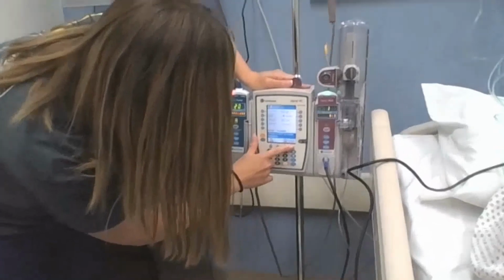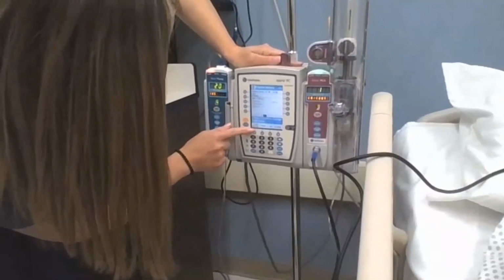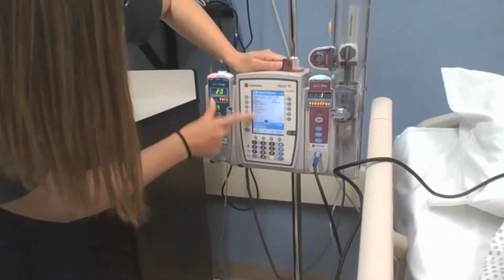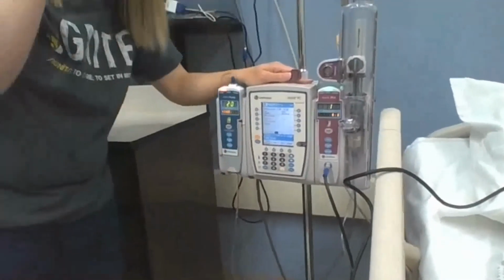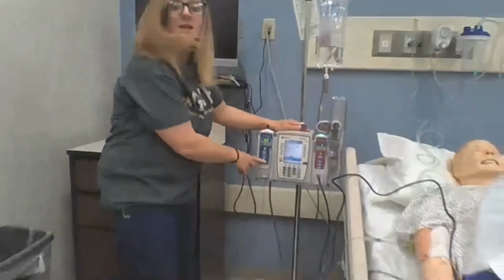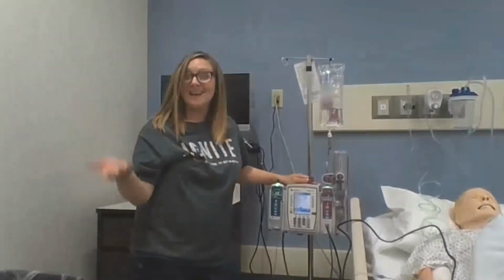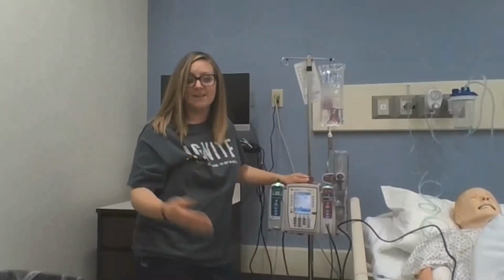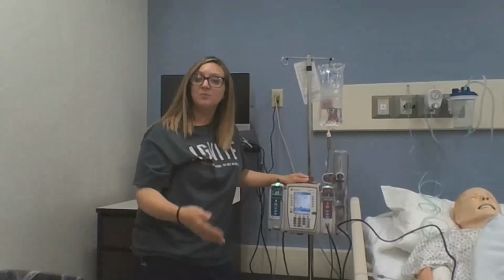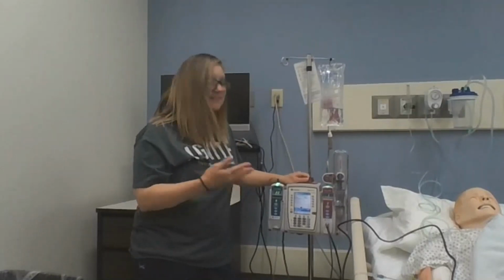You can also clear your history. So when we do that, you can go to clear history, and it will confirm that you want to do that. And you can still refer back to your 24-hour totals and see those. But that way it sets your next nurse up. So your night shift nurse or your day shift nurse that's following you, it kind of sets them up with a clear history screen so that they know what happened on their shift, but they can still refer back to their full 24-hour totals. So this is PCAs.